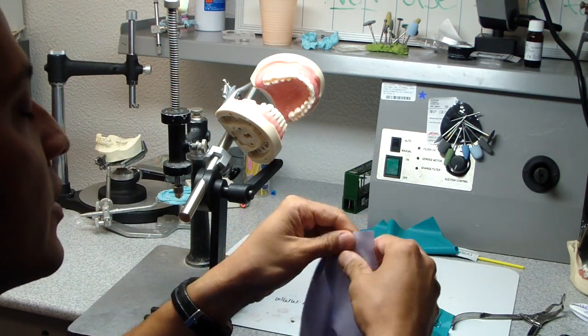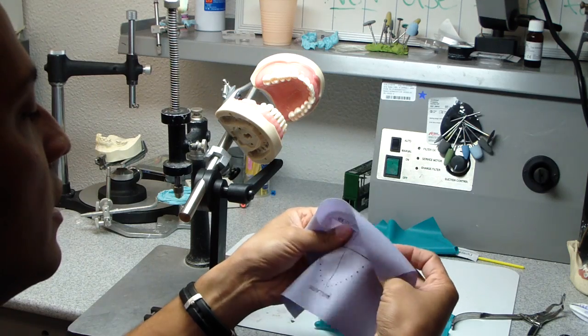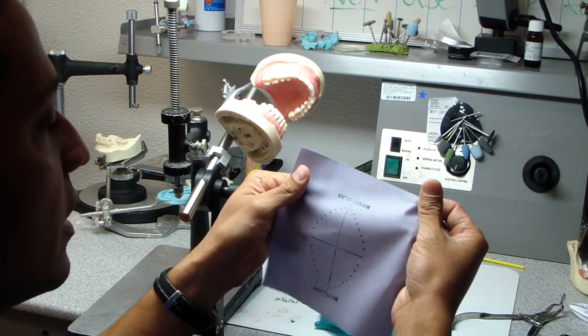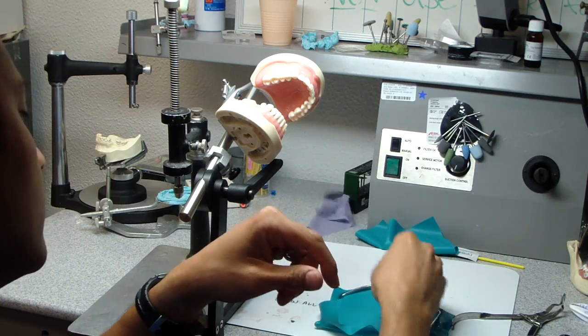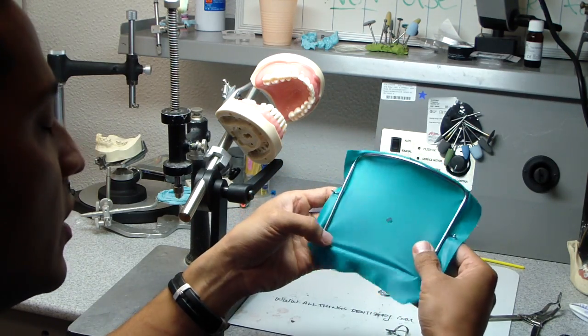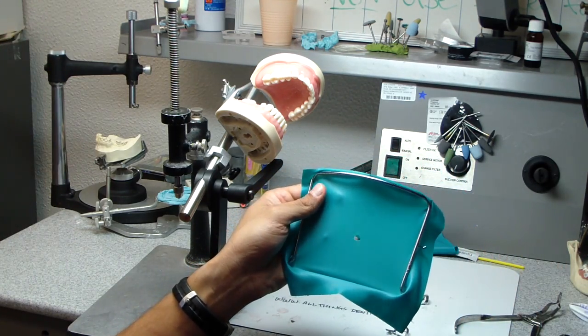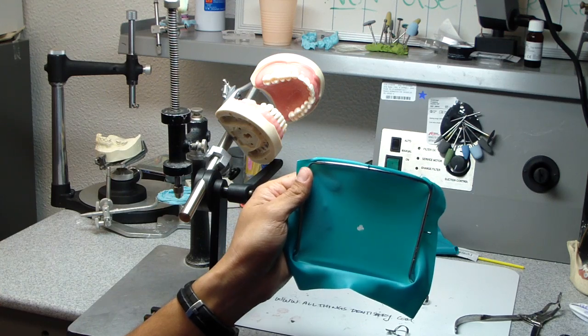The vintage latex always seems to tear and I never really got used to, I never really understood this stamp. It's really straightforward, but honestly at some point it gets frustrating. Placing rubber dam should be simple, but at times it's not.